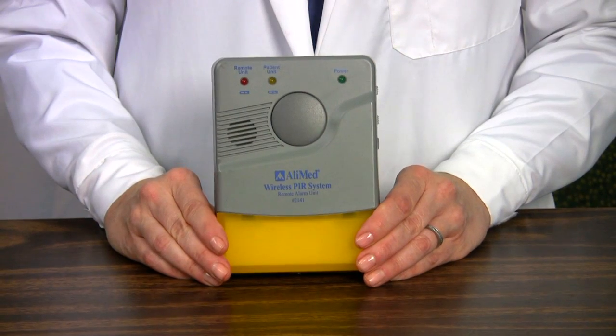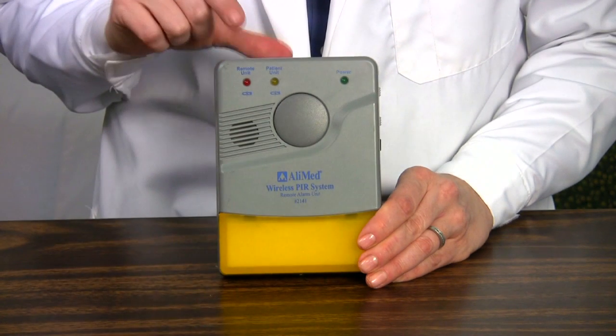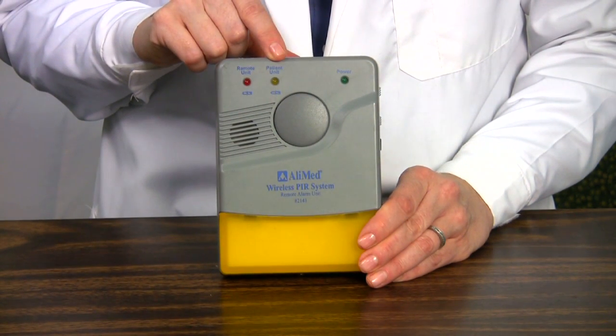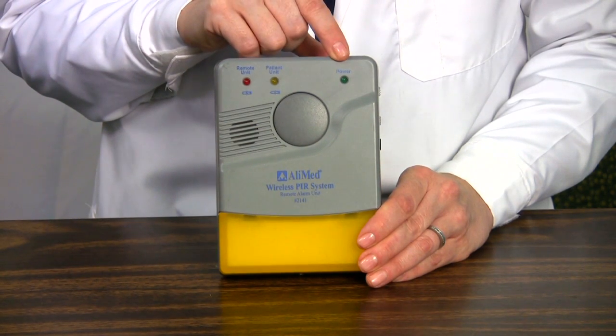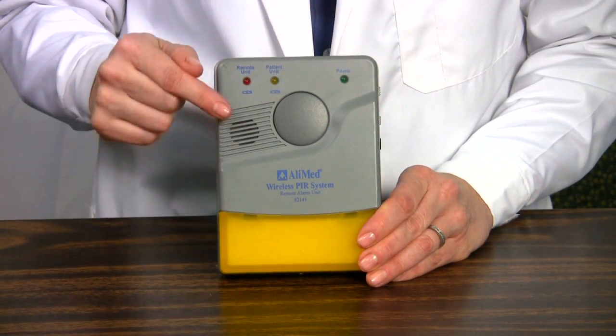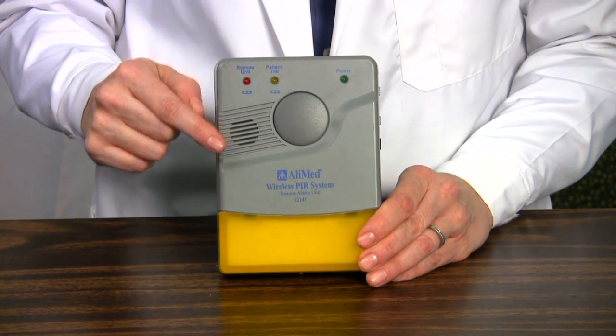On the front is a series of three alert lights. A low battery indicator for the remote unit itself that illuminates red, a patient unit low battery indicator that illuminates yellow when the PIR alarm unit battery is low, and a green power on indicator. The front also contains the alarm speaker and the accompanying flashing alert light.